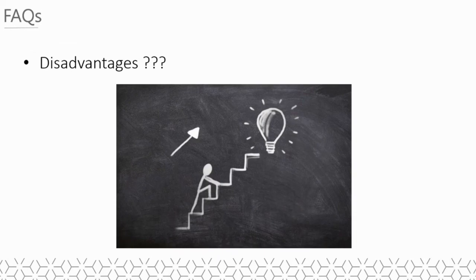And a very frequently asked question is regarding the disadvantages that can be associated with the device and with the technique. The only disadvantage is probably the learning curve. It is a new device and a new technique, and there will be a few hurdles before you become an expert. You really have to do it a lot and communicate all of your questions and concerns to your experts so that we can help you and guide you along the way.